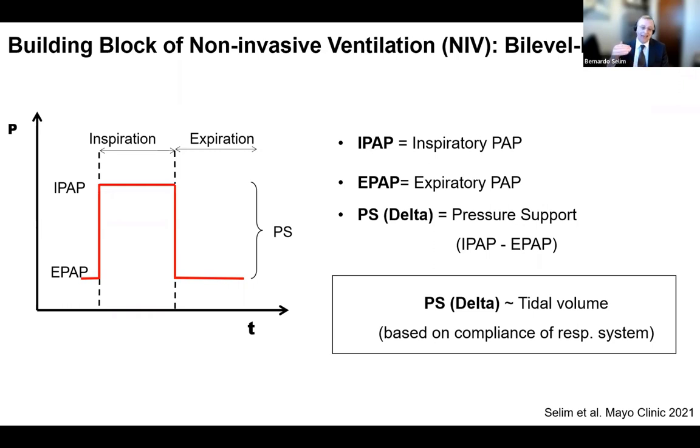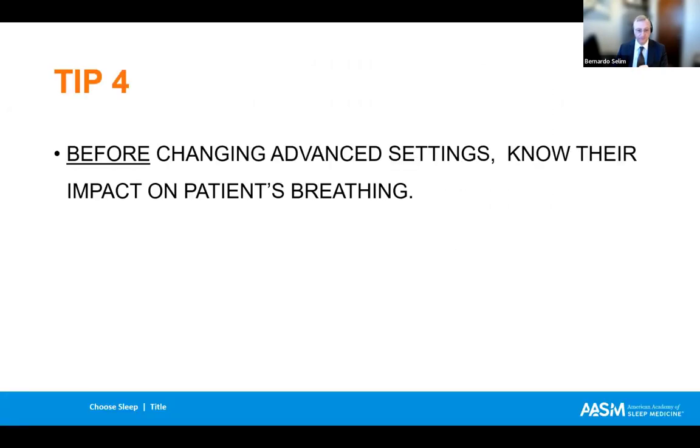So every time you want to ventilate someone, these settings need to be understood, but also they need to be understood in the concept of the compliance of the respiratory system, meaning who is the patient that you have in front of you. Numbers are numbers, but they do not necessarily translate physiologically into a specific tidal volume. You need to see what is the result of your intervention.